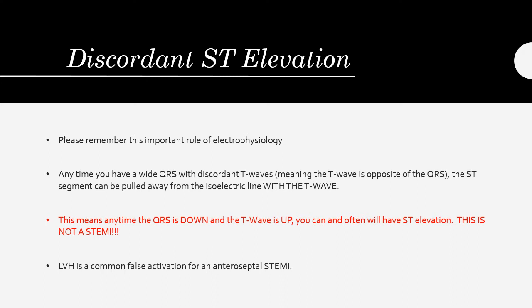To qualify as STEMI, you have to apply the Sgarbossa criteria, and so the ST elevation would have to be greater than 25% the depth of the QRS complex. So if you have a 20 millimeter deep S wave, you need 5 millimeters of ST elevation before it qualifies.